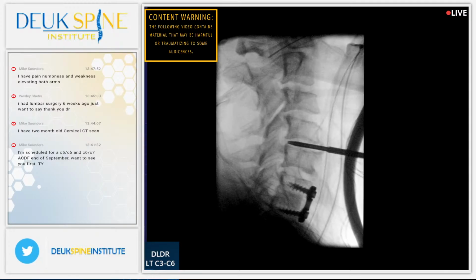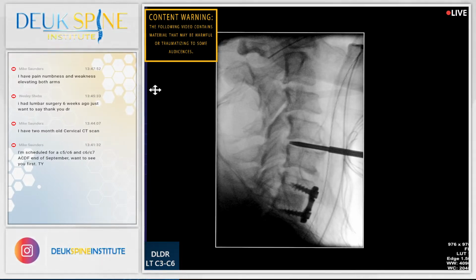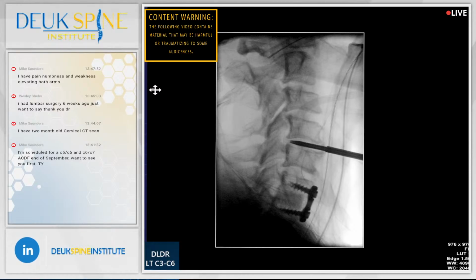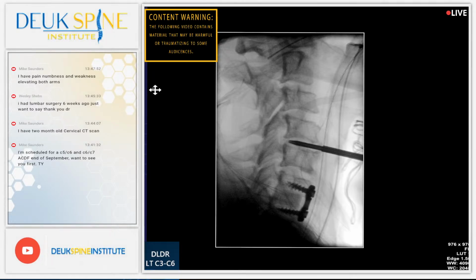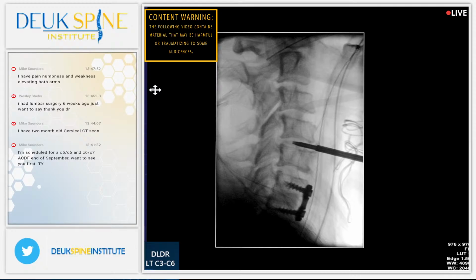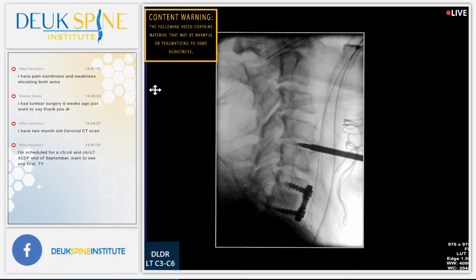Shot. All right, so I'm bringing the tube down. Also, ACDF, you're going to be on painkillers for weeks or months after surgery. They're going to give you narcotics. Narcotics are dangerous. They're addictive. People die from using narcotics that the doctors prescribe. Prescription narcotics, number 1 reason for fentanyl and heroin addiction on the street. 80% of the street's heroin addicts are former patients that had back pain, neck pain. Doctors gave them pain pills, narcotics, they got addicted. Couldn't function anymore.